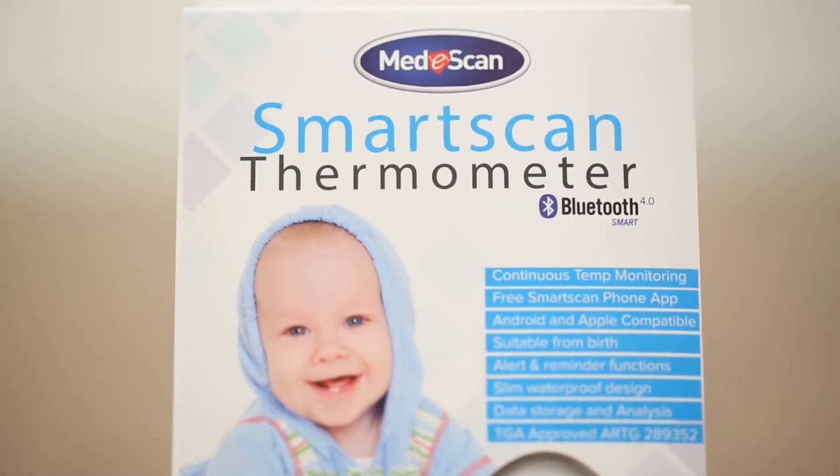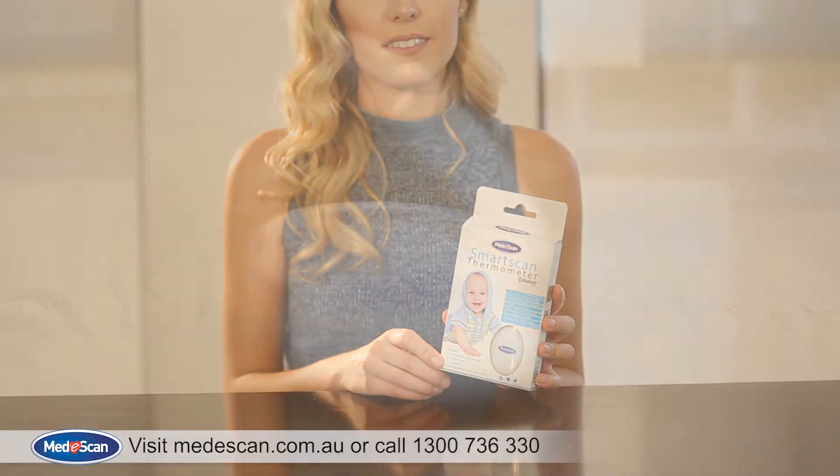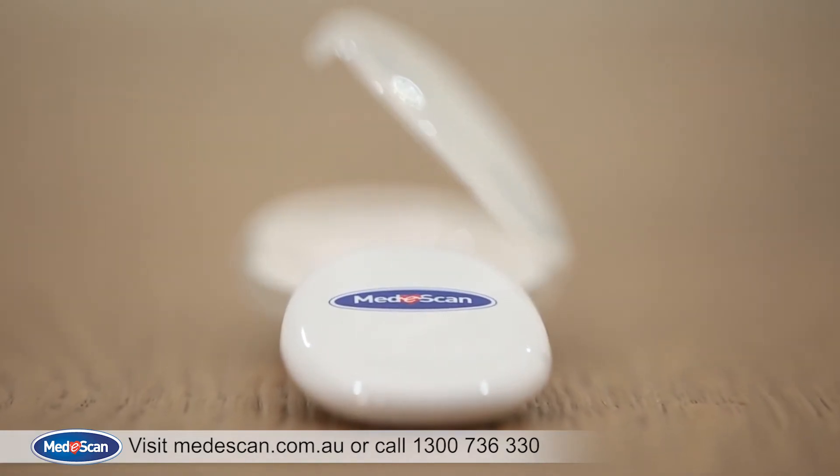Thank you for purchasing the SmartScan thermometer. This video is to demonstrate how you can use your new SmartScan thermometer and how to take advantage of the features it provides.